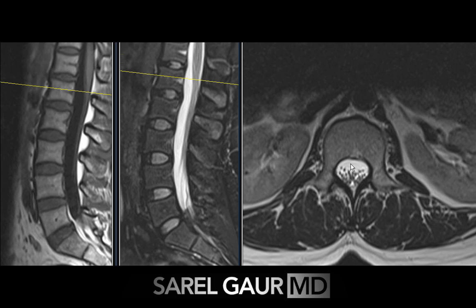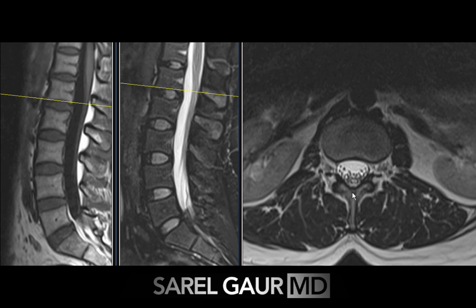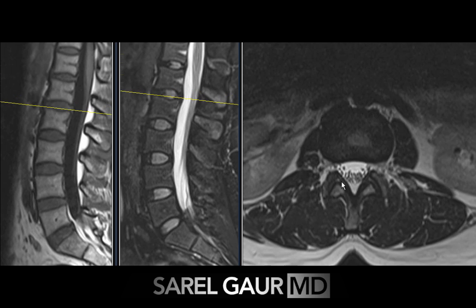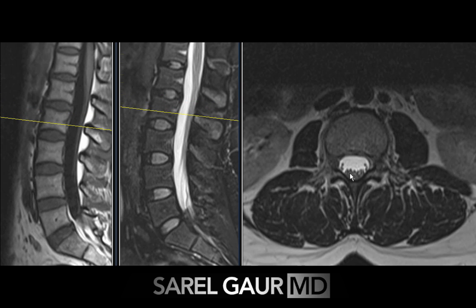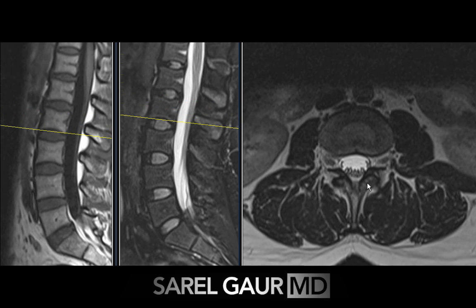Then I basically look at the nerve roots on the axial. As I trace these nerve roots down, they should be fairly separate from one another, floating in the CSF sac. There shouldn't be any evidence of arachnoiditis or inflammatory process involving these nerve roots.